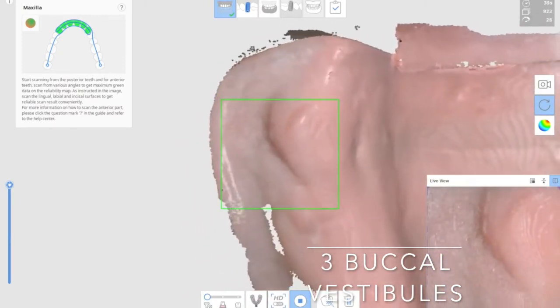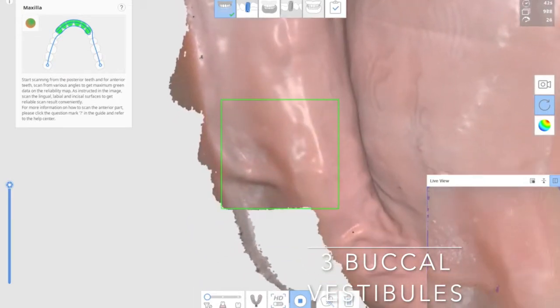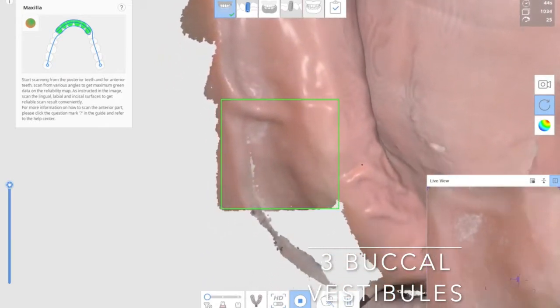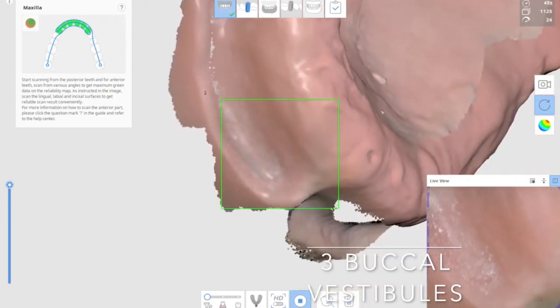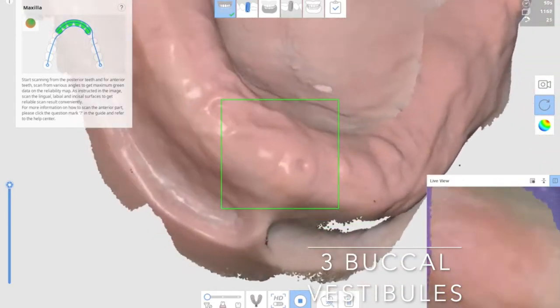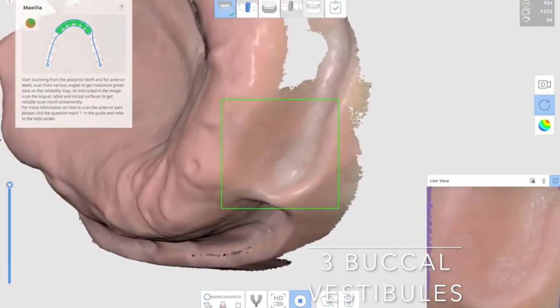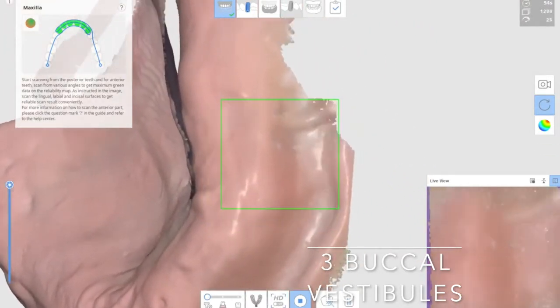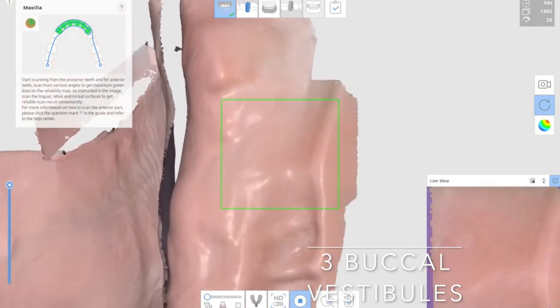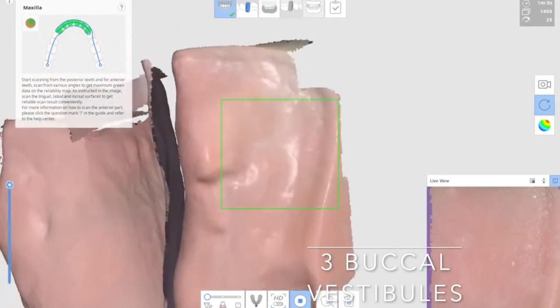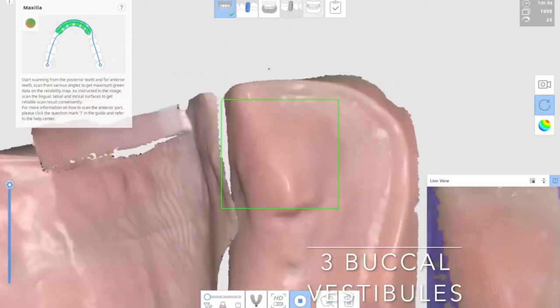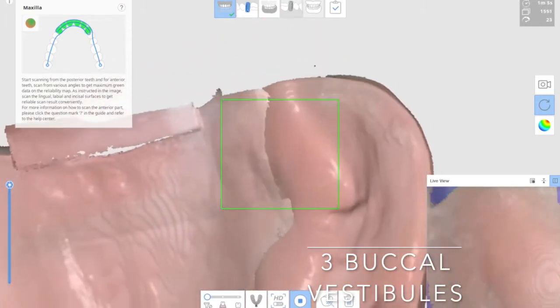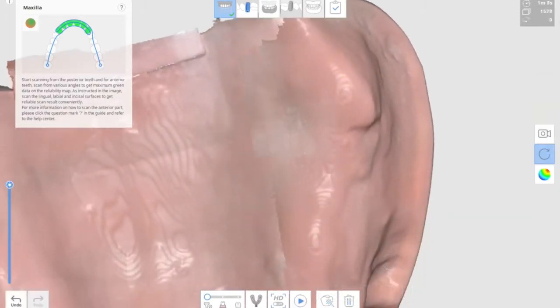In this case, you need to rotate the tip so that you could cover the undercut area of the vestibule easily by rotating the tip. In actual cases, you may do this with your bottom hand holding. Once you optimize it, it will form the final maxillary full mouth scanning.